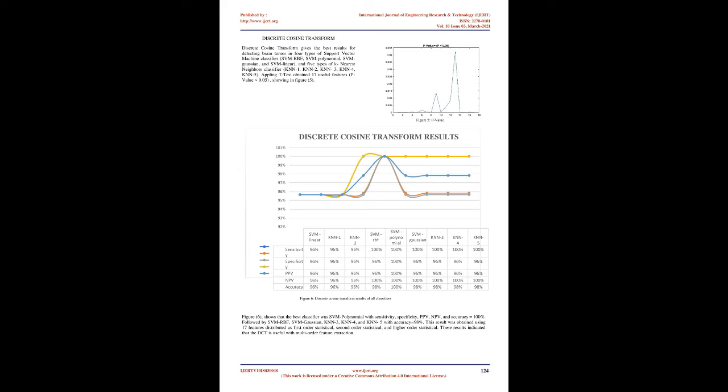Feature extraction. Figure 3, CAD processing blocks. We have conducted many feature extraction functions, which act as a mathematical description of the samples' characteristics to help classifiers distinguish normal from abnormal cases. After applying the cosine transformation to ROIs, we investigated 23 features and only 17 passed the t-test with a p-value less than 0.05. Statistical features on ROIs. Those features are mean, STD, square of STD, mode, median, percentile, third moment, skewness, kurtosis, max, min.